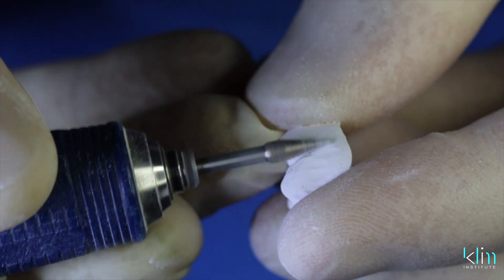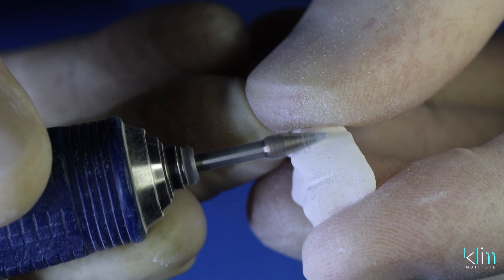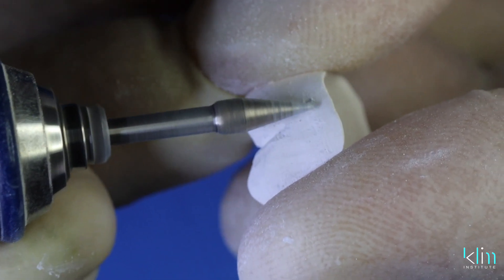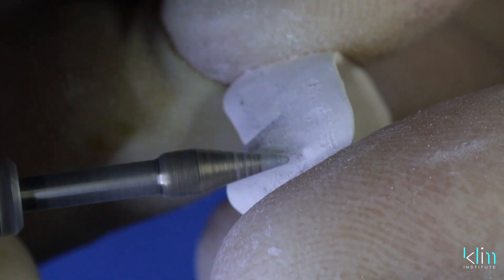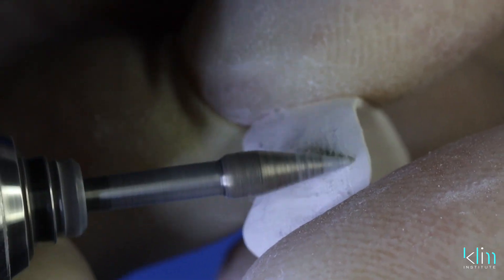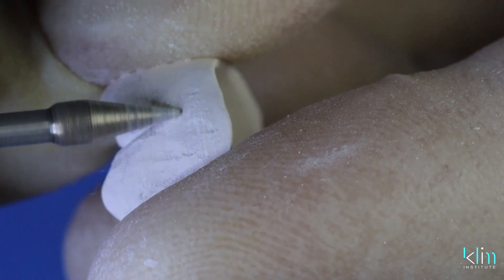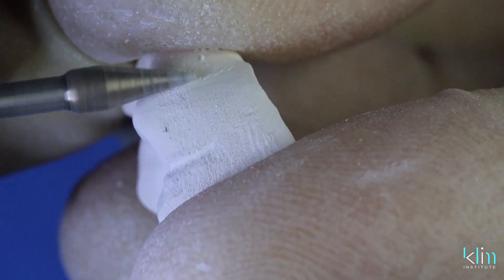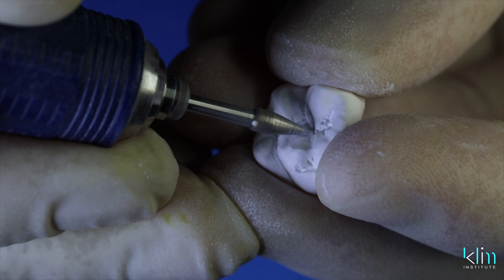Light pressure — always keep the burr moving so you don't gouge the soft zirconia. This is perikymata: it's a light dance with the tip of that burr across that surface. Place this on before you sinter, because it's almost impossible to do after sintering. Make any other further refinements at this stage as well.